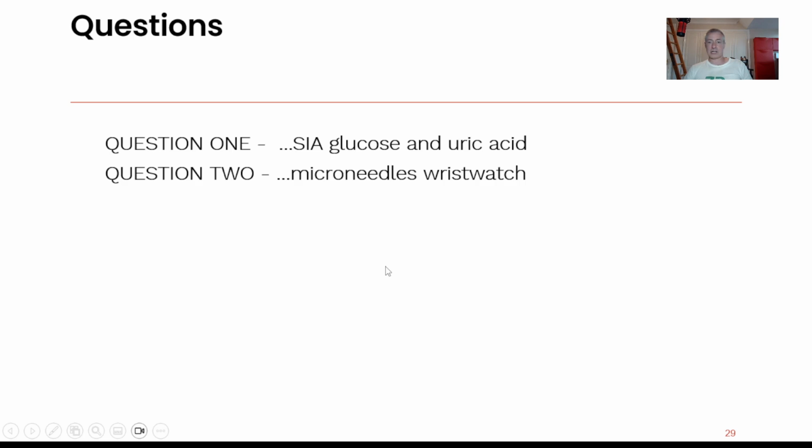Microneedle wristwatch. You had some questions about calibration. I talked about the glucose meter, for example. You had some questions about the needle sizes. I've given you links to patents, specifically one of the patents where they actually do call that out. To insert, maybe I didn't make that point, the microneedles are actually here. We are looking for semiconductor companies, by the way, who are willing to become involved in this quite heavily. And then to insert it, you just pull on the strap and that will then insert.